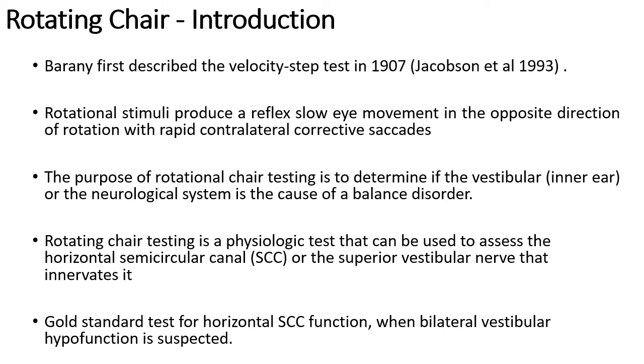As an introduction, this test was first described by Barany in 1907 when he recorded a nystagmus after a patient was manually rotated while sitting on the chair. This was nystagmus generated by sudden deceleration.